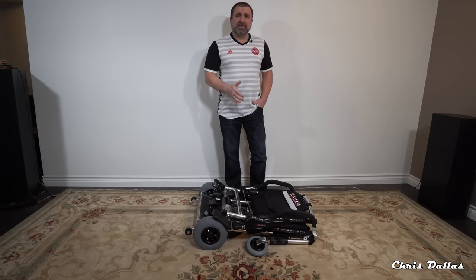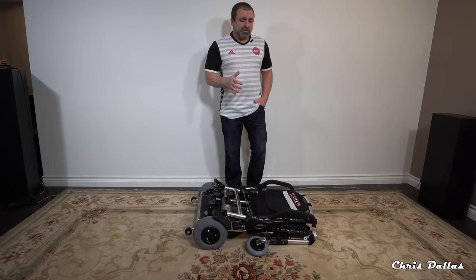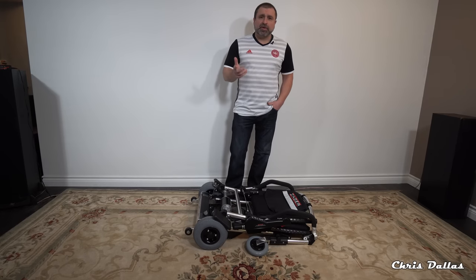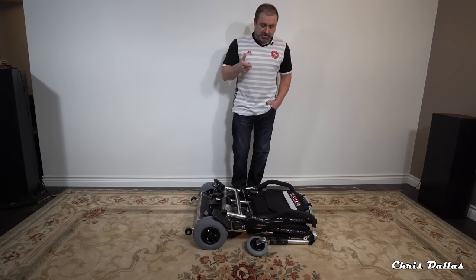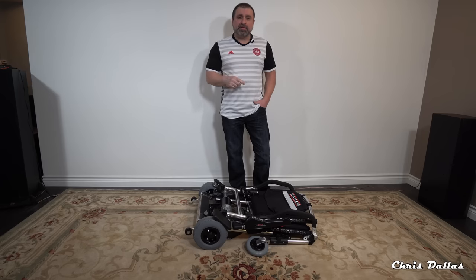This is the world's lightest portable electric chair. Electric wheelchairs usually weigh anywhere between 200 and 350 pounds. Well this one here only weighs about 37 pounds and you can take it with you wherever you go.